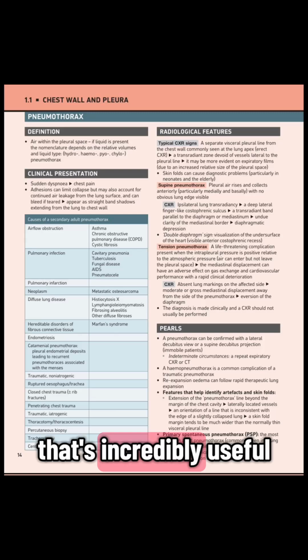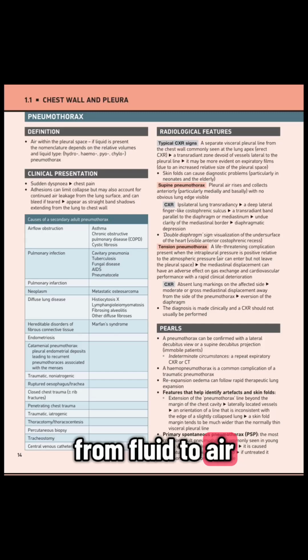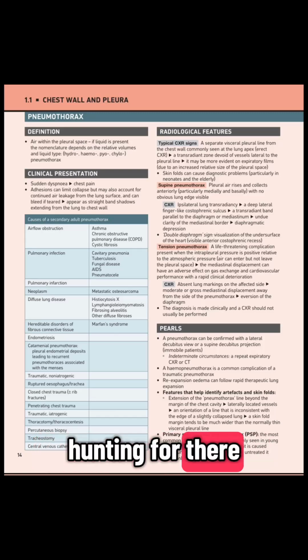That's incredibly useful context. Okay, let's switch gears from fluid to air. The opposite problem. Exactly. Air in the pleural space, a pneumothorax. What's the visual signature we're hunting for there? Air looks, well, blacker than lung on X-ray, right?